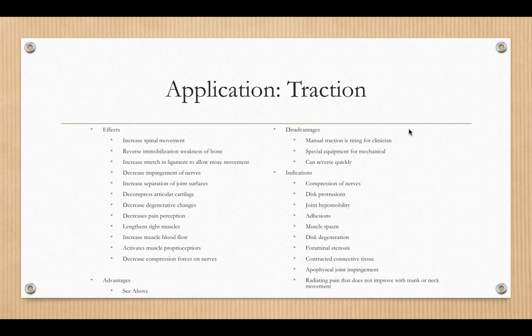So again, just to review our applications, so the effects we're going for, again, some of these would be, again, then into our indications. So we'd want to gain these effects in order to affect the conditions that the individual has. So the advantages of using traction is that we can do some of these effects that we haven't been able to really do with any of our other modalities so far.